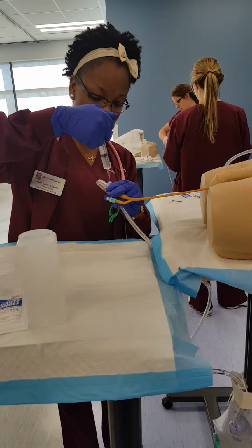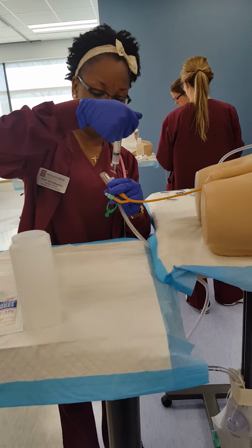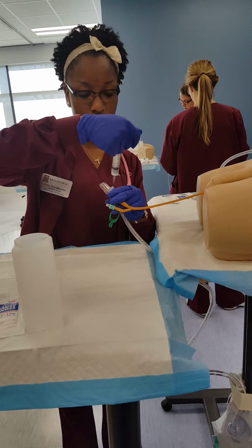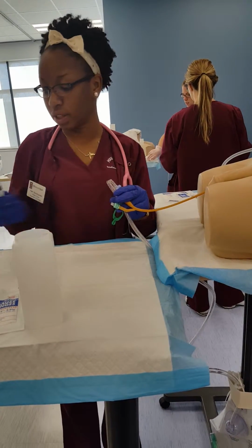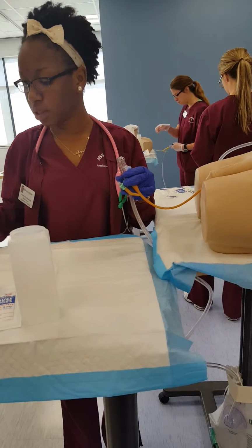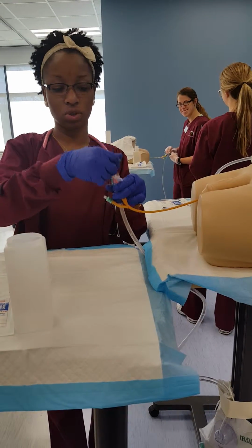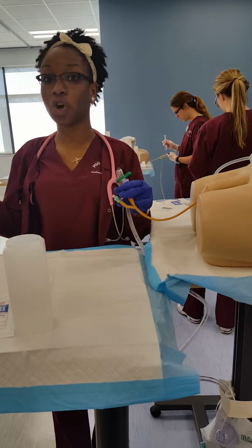I'm also making sure that not so much is flowing down into the catheter. So everything is going down in there, towards the penis. I'm going to keep this kinked for 2 hours because that is the doctor's order.